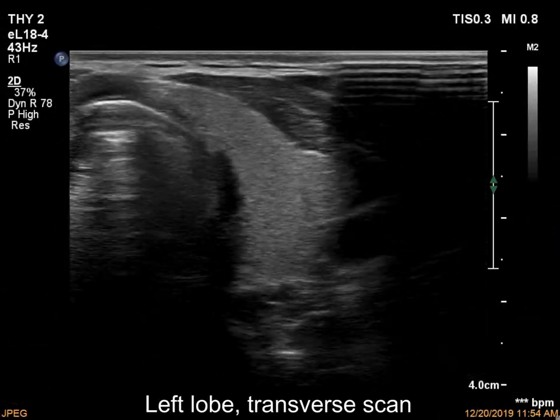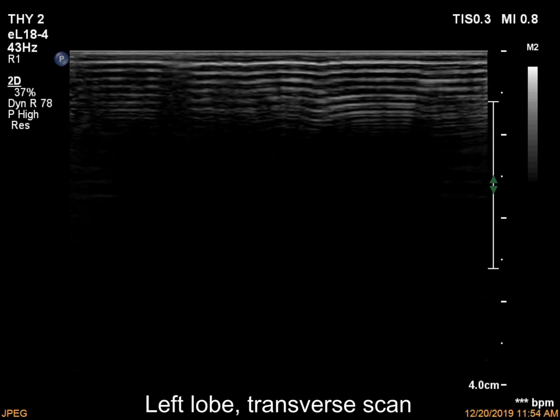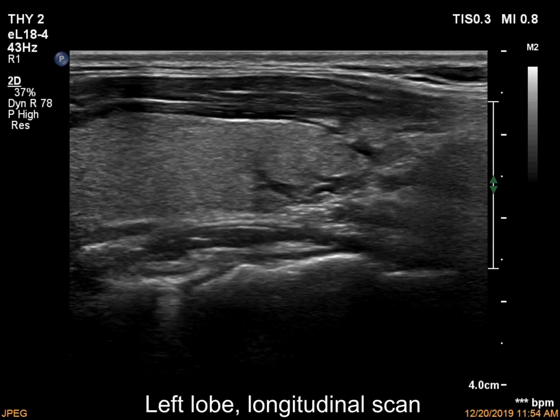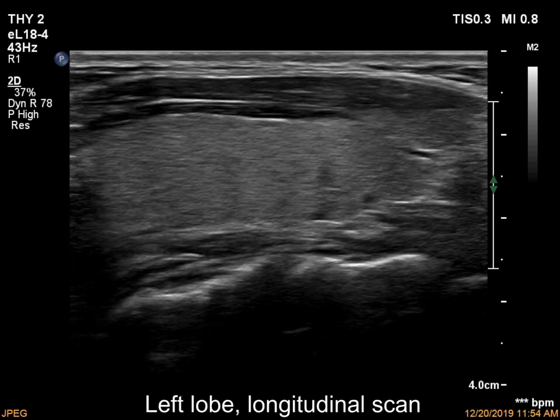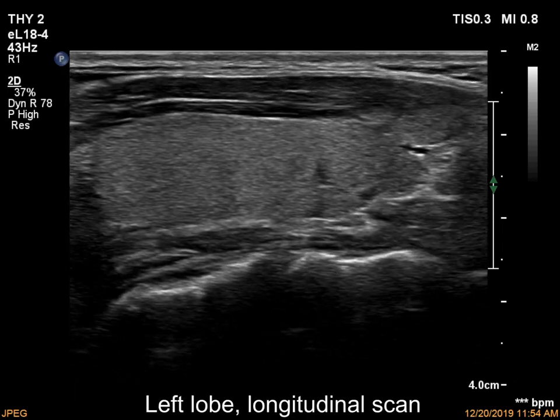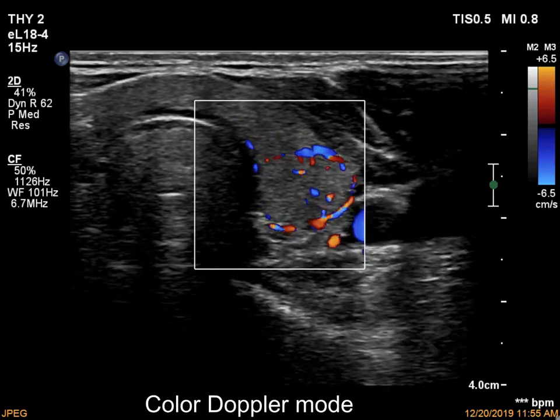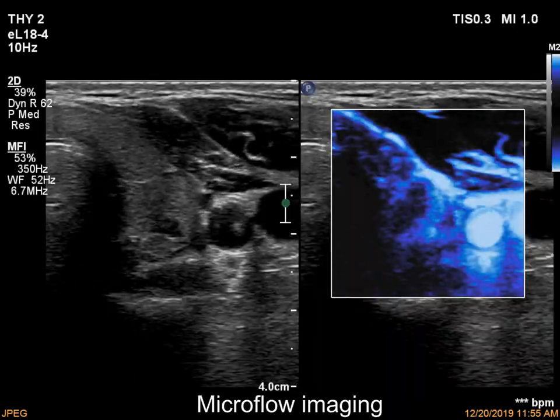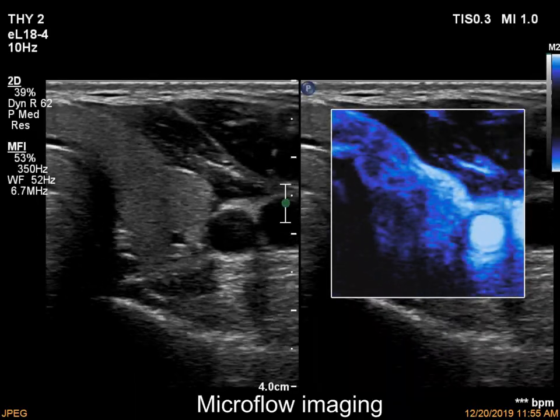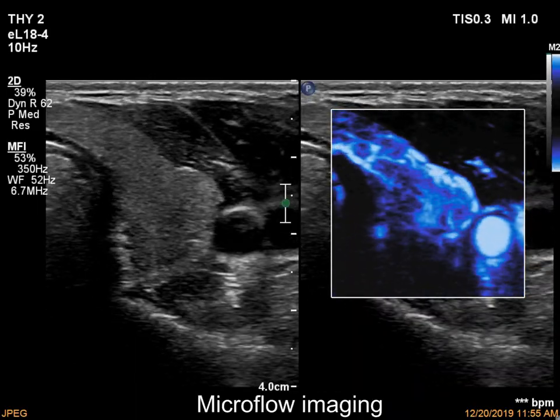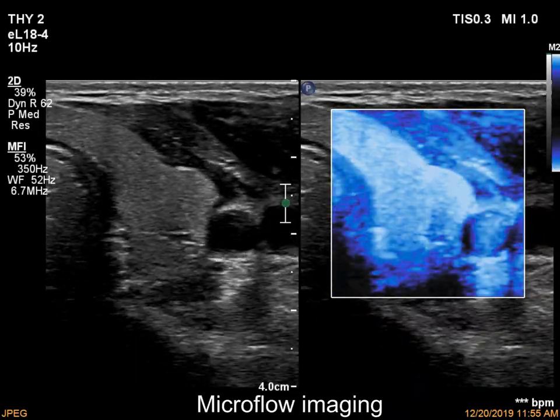The left lobe has a similar presentation. This ultrasound pattern, including the normal vascularity, makes any thyroid disease unlikely in a patient who did not take thyroid drug.